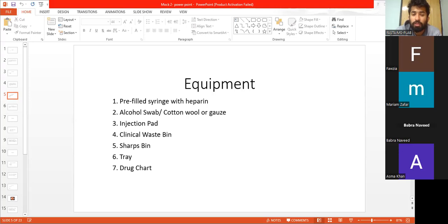Please safety net the patient that the injection site might feel a little sore for 1 or 2 days. However, if it lasts greater than 48 hours, they need to inform us.